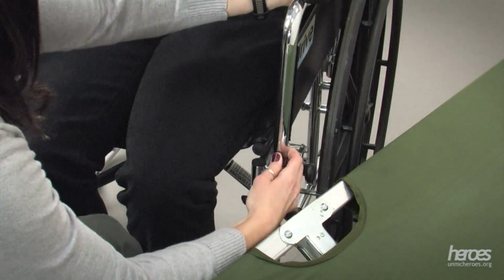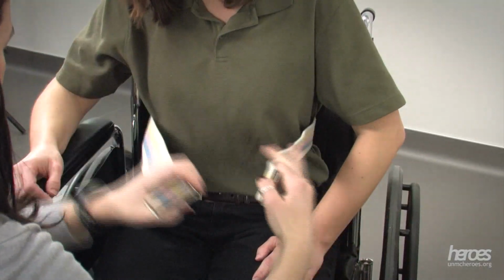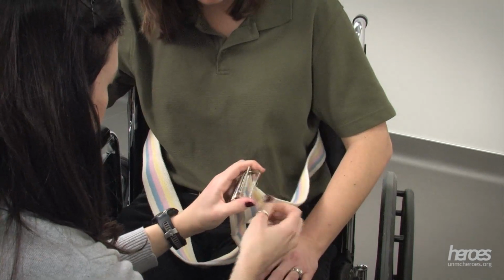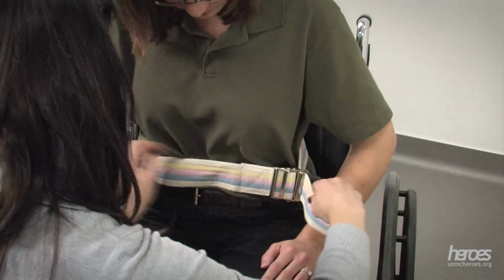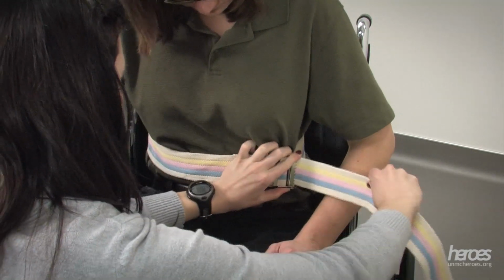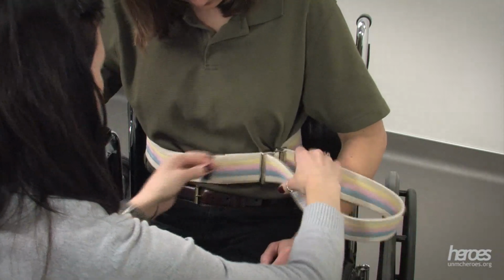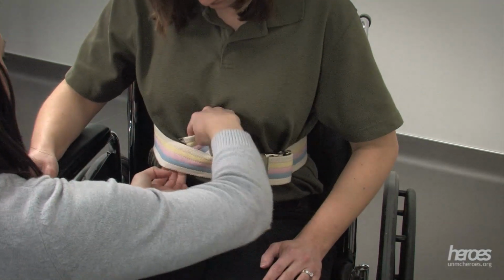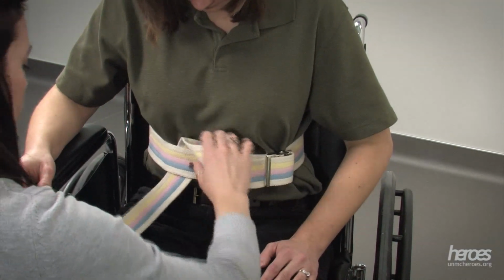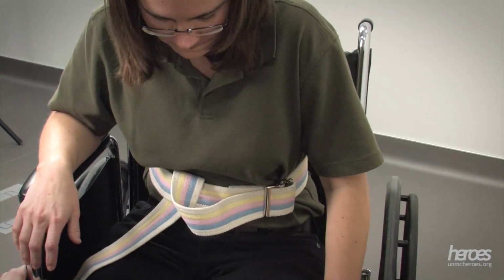Next, remove the armrest that is closest to the cot. Fasten a gait belt around the individual's waist for safety. Thread the head of the belt through the teeth of the buckle first, then through the other end. Make sure the belt is nice and snug. Ask the individual to then scoot forward in the wheelchair.